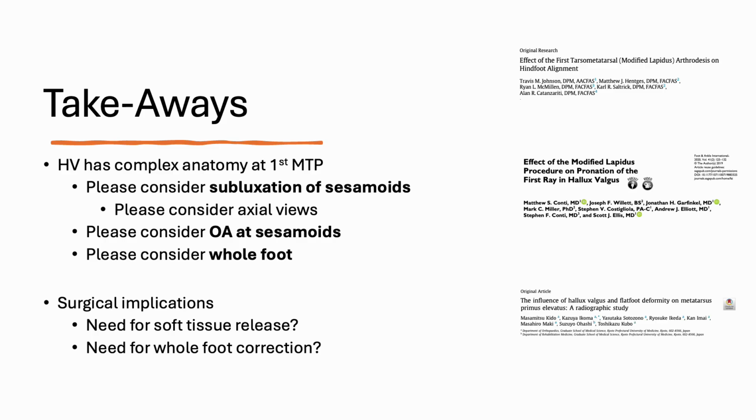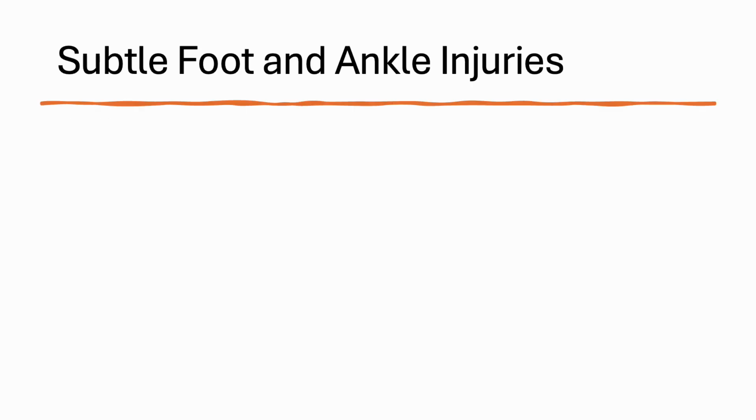So don't be afraid to do it or get pushback from your institution or say, I'm a bunion procedure person, but if I get weight-bearing CT scans, I might make extra money from a financial standpoint, or your institution might make extra money. Ultimately it serves the patient. It's not serving you. You might indirectly get benefits from it, but ultimately we're trying to serve patients, so it's the best of both worlds, in my opinion.